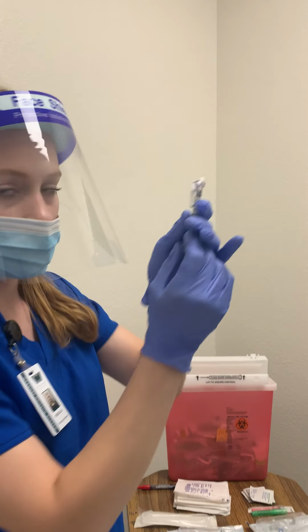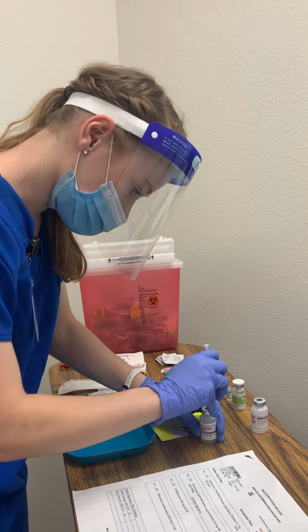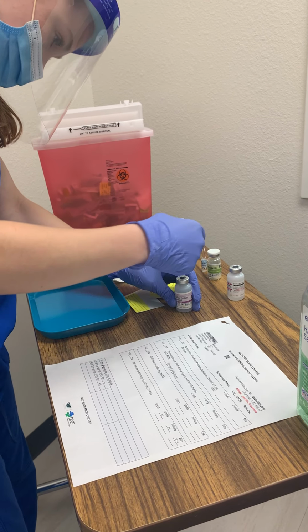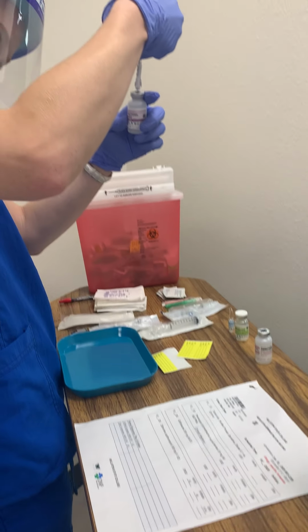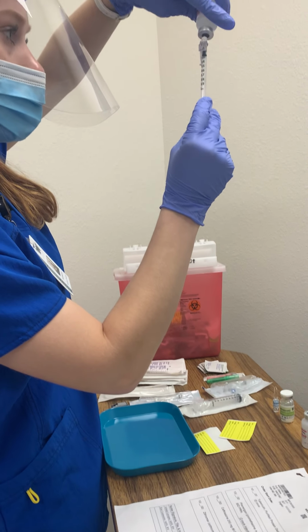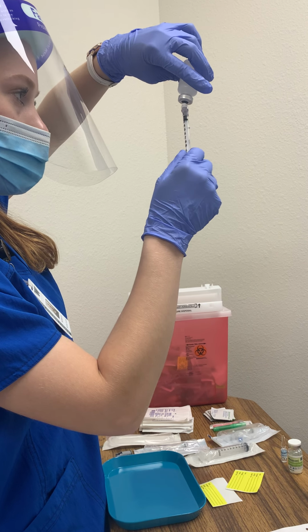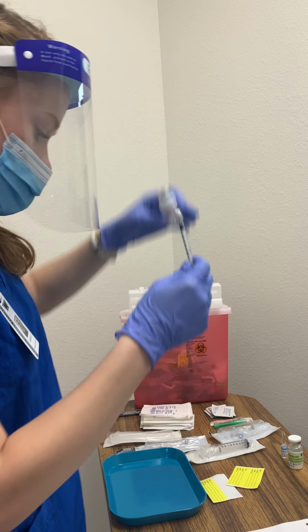So 0.1. And then I'm gonna be injecting this in, making sure it's above water level, pushing it in, and turning. Now I got a little bit of air, so I pulled back more than I needed.